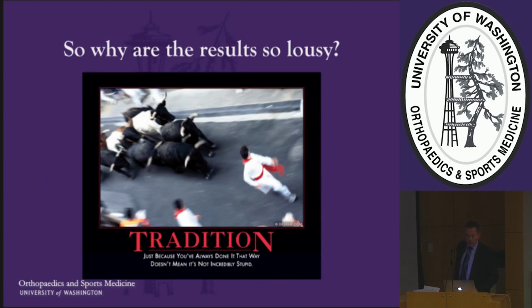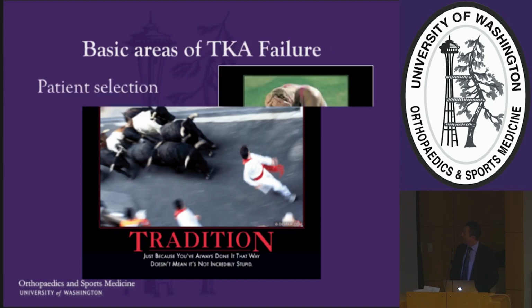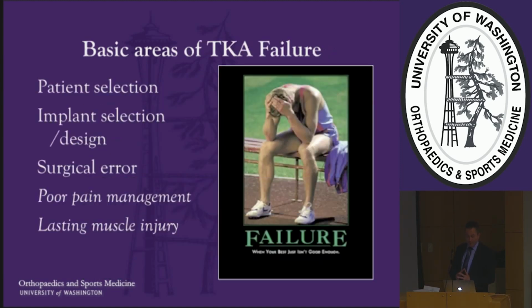So the question is, why are our results so bad? There are a few issues here. First is patient selection, second is implant design. Bad implants do worse. Surgical error certainly contributes. Then poor pain management and lasting muscle injury. And I would say we've concentrated a lot on numbers 1 and 2, less so on number 3, and not at all on the last 2.